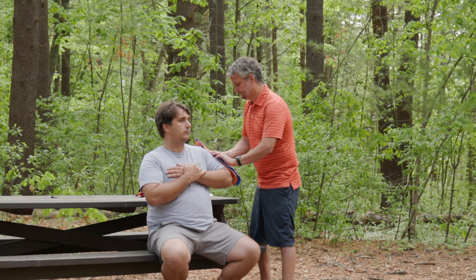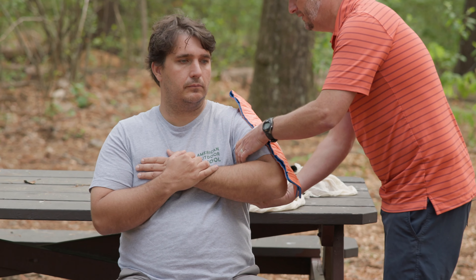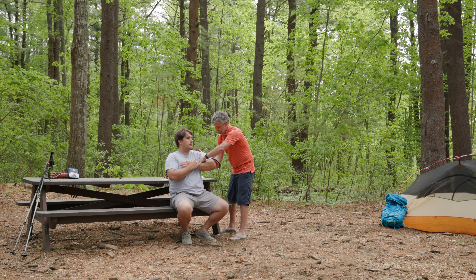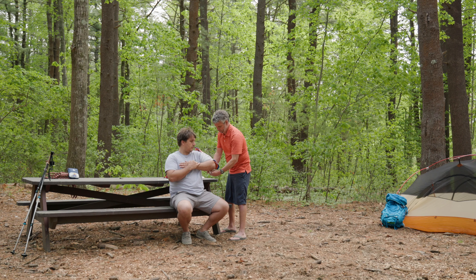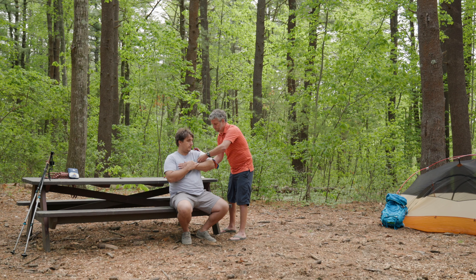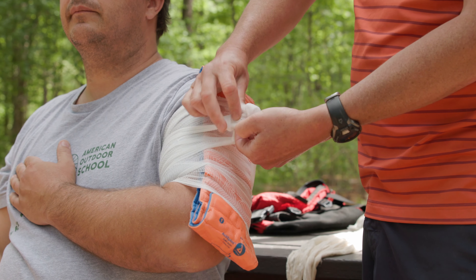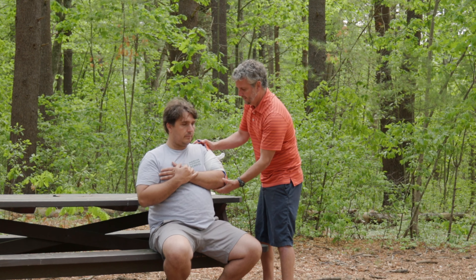I've got my splint set up and I'm going to use my roller gauze to secure this splint, remembering to always roll it towards the patient's arm — it just makes your life that much easier. To finish this off, simply take your loop, wrap it around, and finish with one more loop.